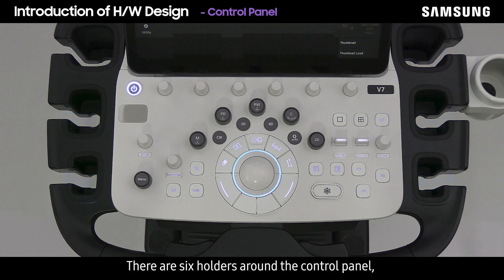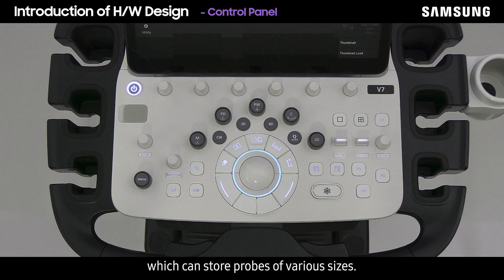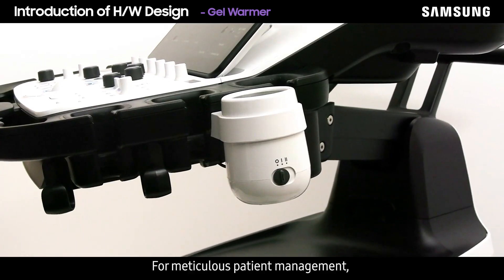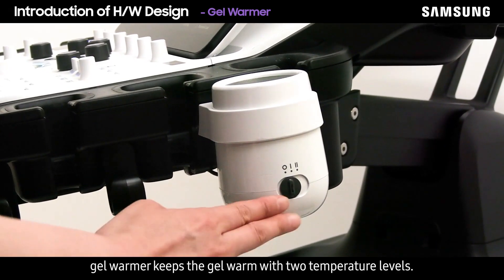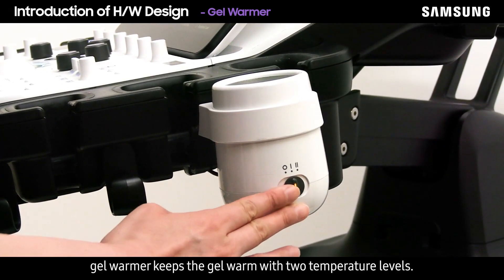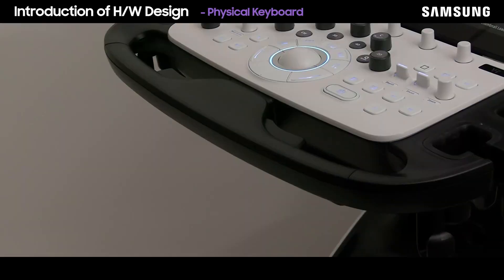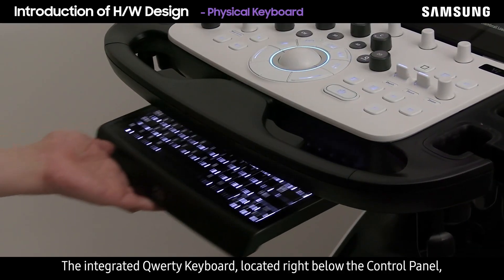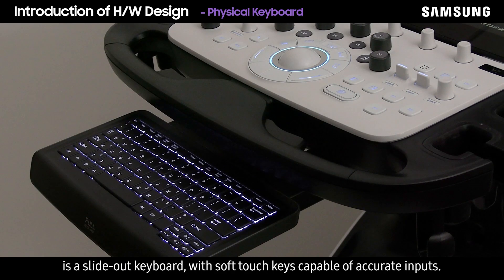There are six holders around the control panel which can store probes of various sizes. For meticulous patient management, the gel warmer keeps the gel warm with two temperature levels. The integrated QWERTY keyboard, located right below the control panel, is a slide-out keyboard with soft touch keys capable of accurate inputs.